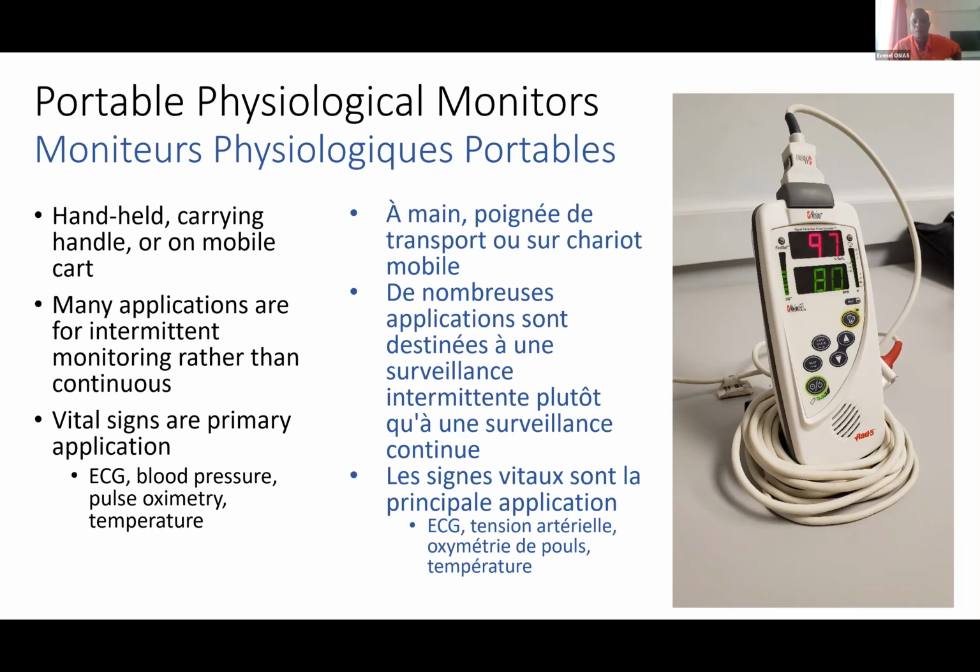We don't say that they do not know what they're doing, but we suspect that during the COVID period, most of the people kind of thought they always need oxygen, but there's no way to control how much oxygen, who needs the oxygen, and how much they are supposed to receive. I think this is something we have to focus on. As biomedical equipment technicians, first we make sure that all the oxygen concentrators are calibrated and have the correct concentration.